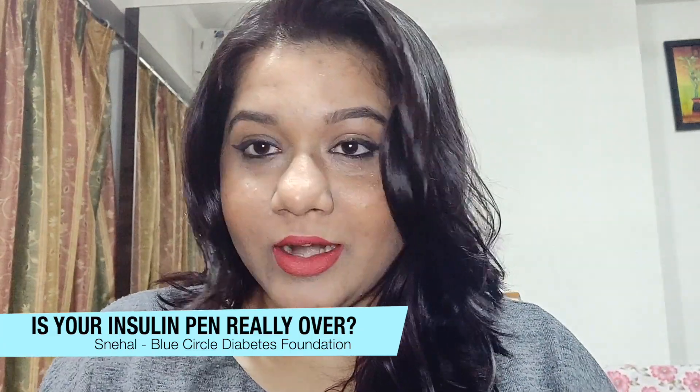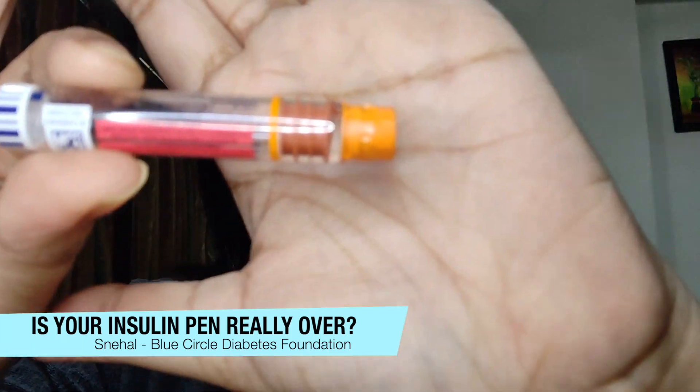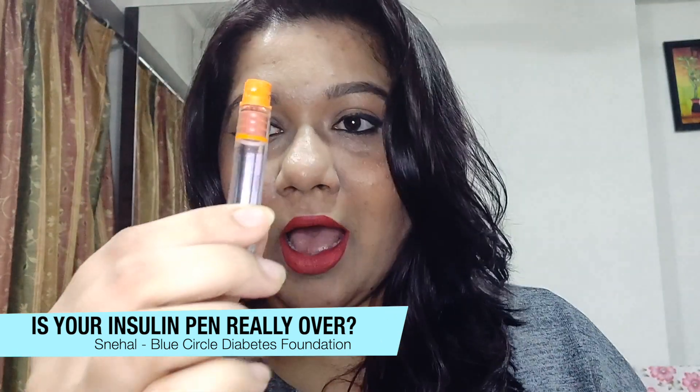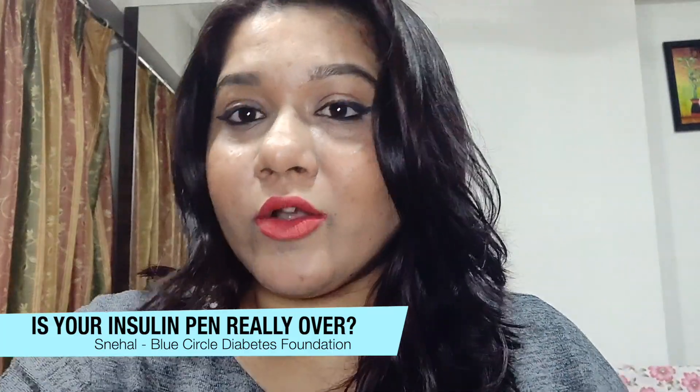I'm going to take the cartridge out from my pen. Now if you look closely at it, there's still some insulin at the very end of it. You may feel that this quantity is very little, but it's not.